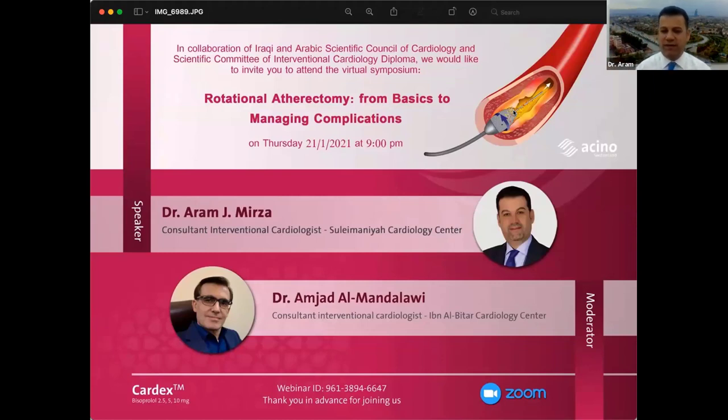But in the vast majority of cases, you should put in your mind that you are going to sacrifice the side branch. However, to be honest, it hasn't happened with me, like the case I showed you, which was heavily calcified. But you should keep in mind that after putting a stent in the main vessel, it might be very difficult to recross the side branch because there is no wire during atherectomy. You have a stent there and a chunk of calcium that has been moving during the rotational atherectomy. So it depends on the size and on the case.